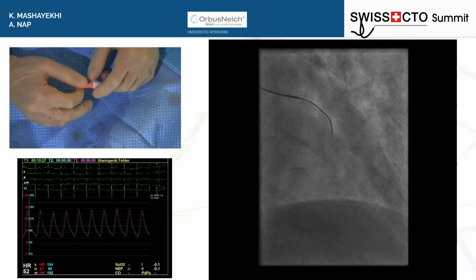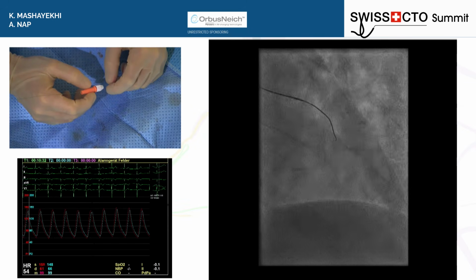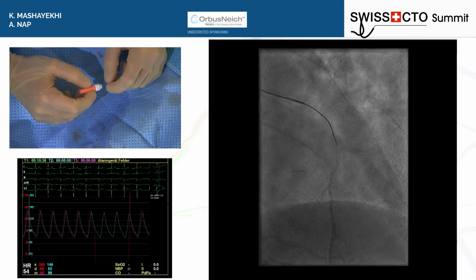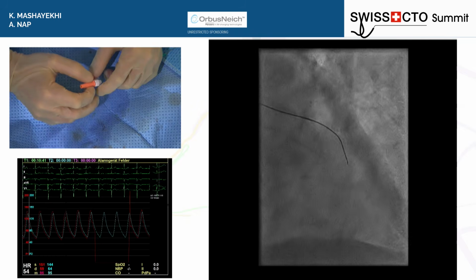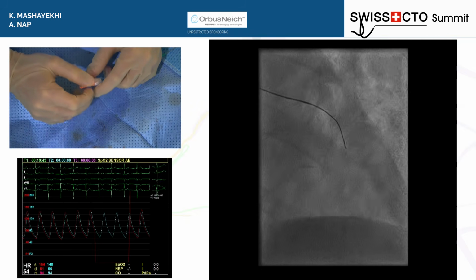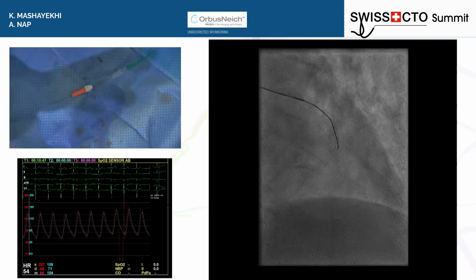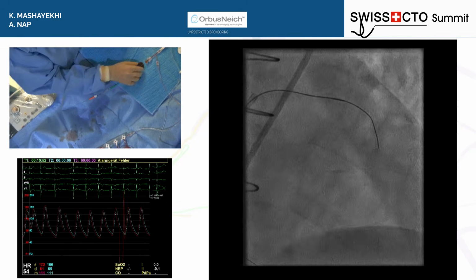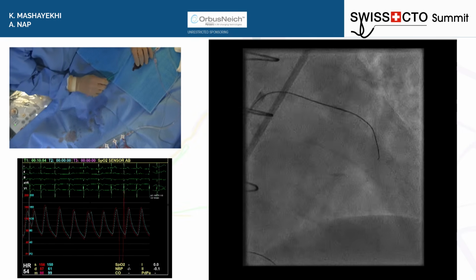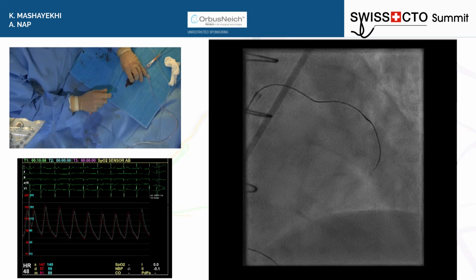But that landing zone is beautiful. It's absolutely beautiful. So I would say, okay, spend another 15 minutes or so on wiring, but actually you're already without a crossbus. You're already adjacent to the vessel, already almost in a good position to drop a Stingray balloon there. Well, that's what we discussed also already. So we're going to try and give it a few more minutes, but if not, we're probably going to convert to an ADR technique.